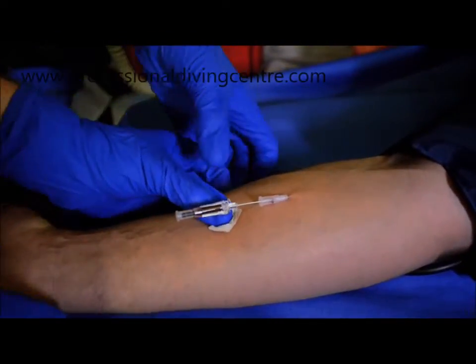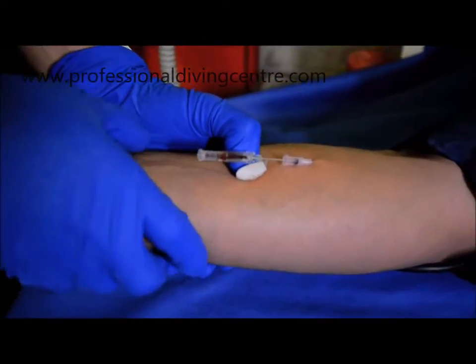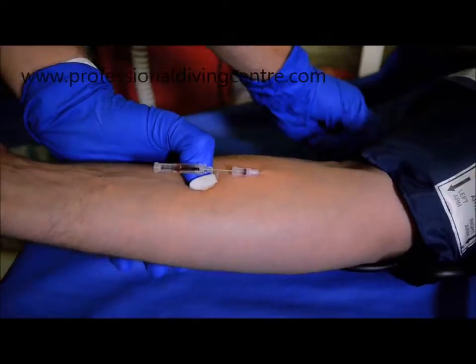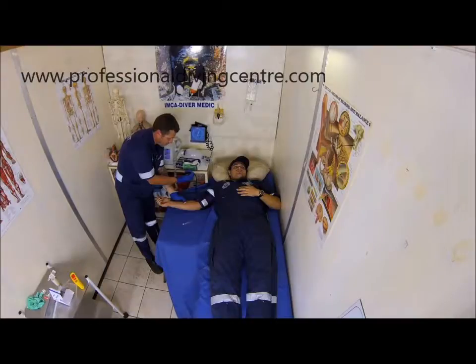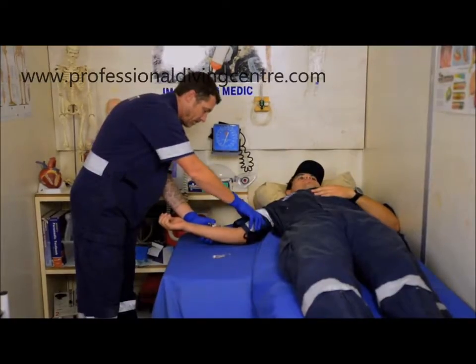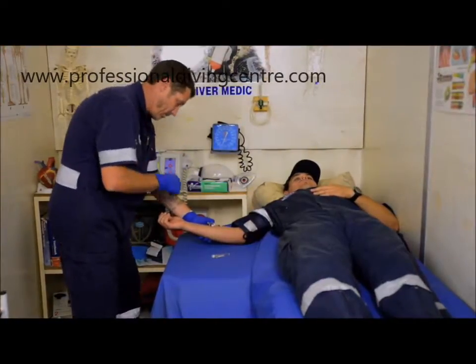Stop advancing the needle when there is flashback in the chamber. Release the blood pressure cuff. Keep the needle where it is and advance the cannula over the needle until it is all the way in.